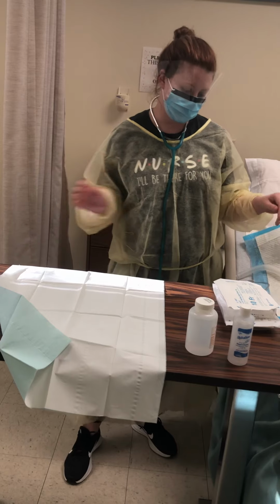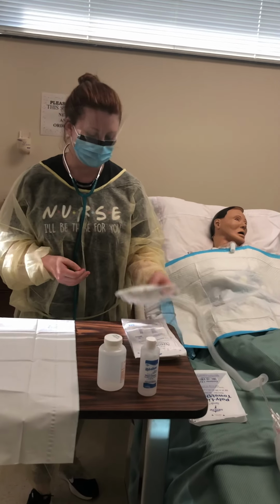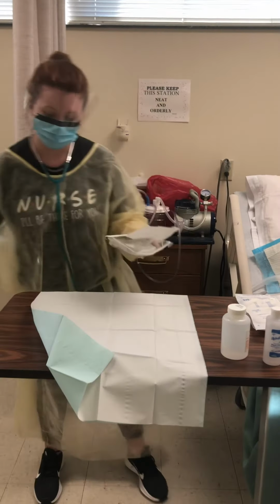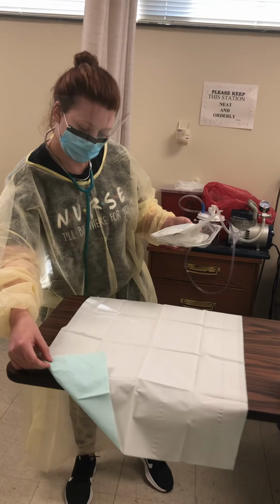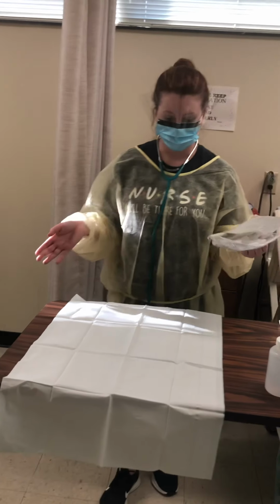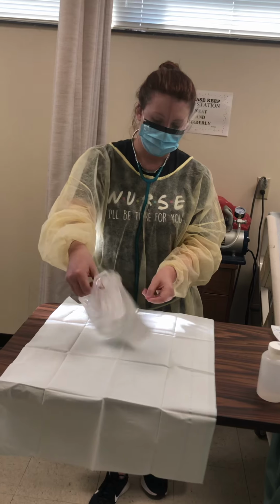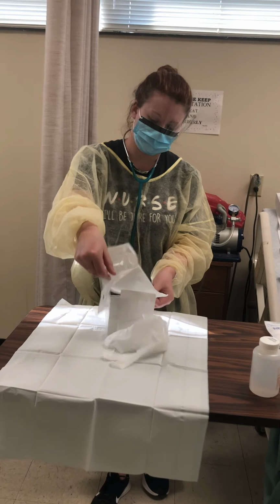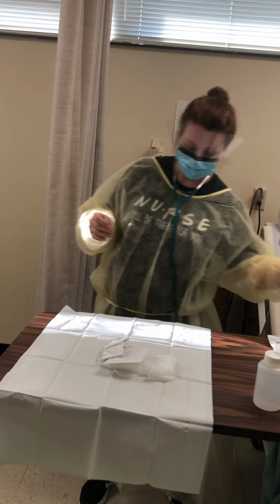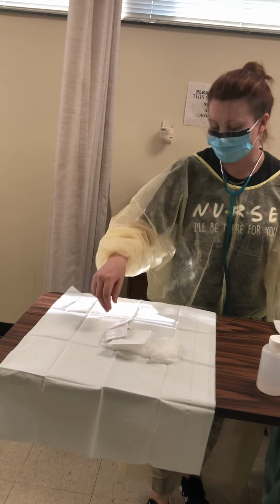Okay, and then I'm going to empty out the contents of my suction catheter kit. And as long as I don't touch past the 1 inch border, it's not contaminated. And I can get my basin for my sterile water without gloves on.